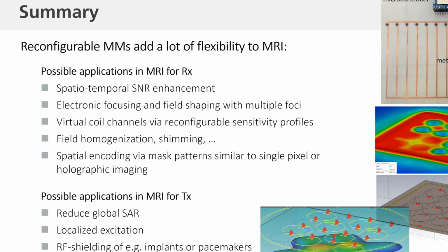Yeah, so I had a look. I haven't tested it on my own yet, but in principle, it's a similar idea and a similar approach. It's just the spatial resolution, which I saw, at least in the publications, was not really convincing yet. We have another question from Robert. Robert is asking, what kind of spatial resolution do we expect to get from novel encoding methods based on metamaterial encoding? What is the maximum matrix size for a 2D image?